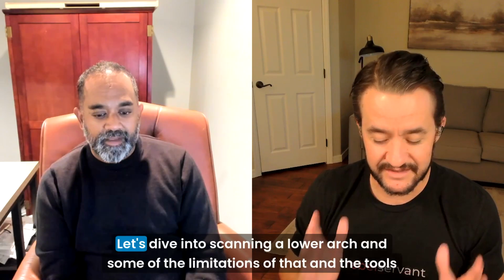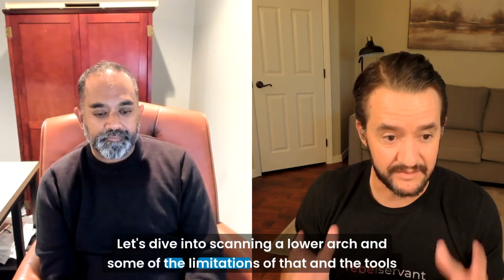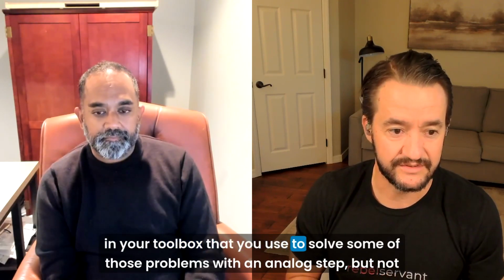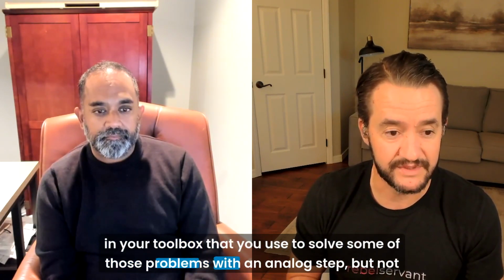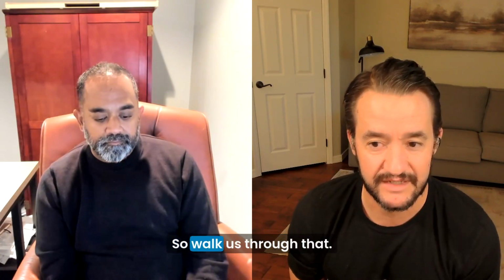So, Dr. Naren, thank you for being with us. Let's dive into scanning a lower arch and some of the limitations of that, and the tools in your toolbox that you use to solve some of those problems with an analog step, but not abandoning the digital workflow. So, walk us through that.